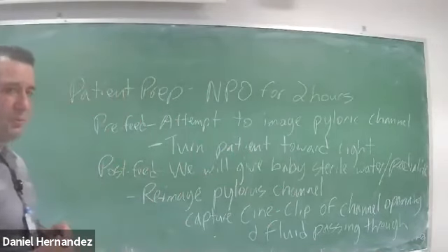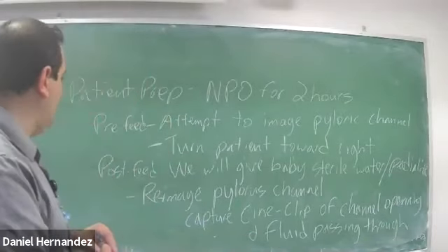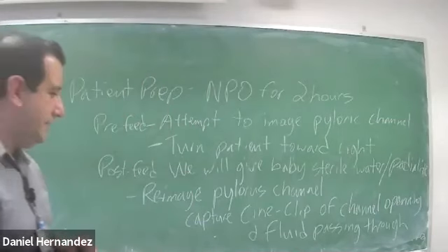So that is just how we prove that it is a negative study for pyloric stenosis. There are some measurements that go along with this study.